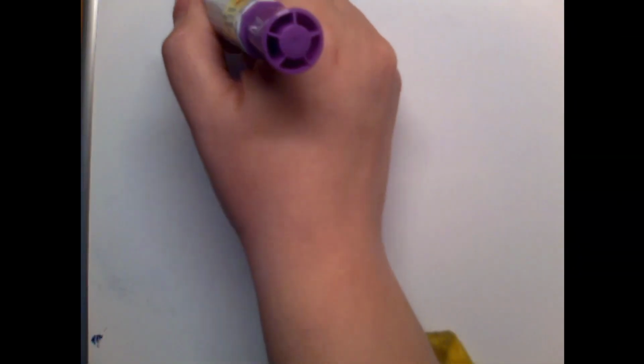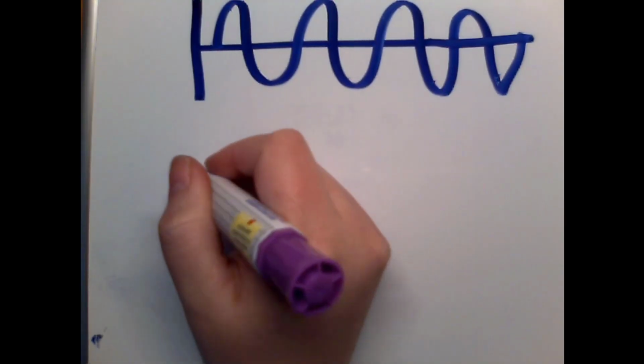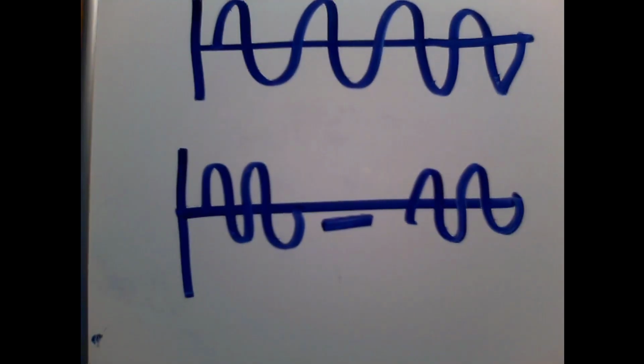So up to this point, we've been seeing our ultrasound waves drawn out something like this, right? That is a continuous wave. There is no break within this wave. What we see with pulse waves then is something like this. There's a pulse, and then there's a break, and then another pulse is sent out. And that is really what is happening in ultrasound.